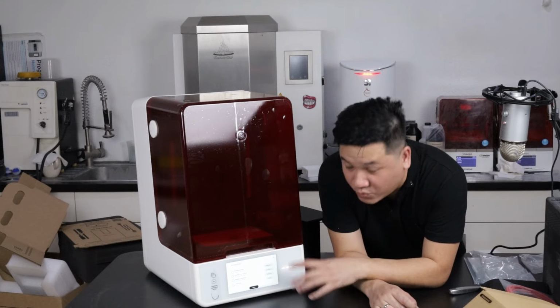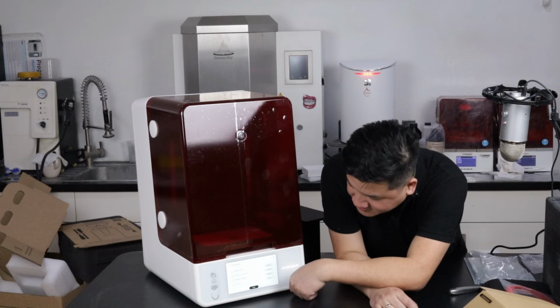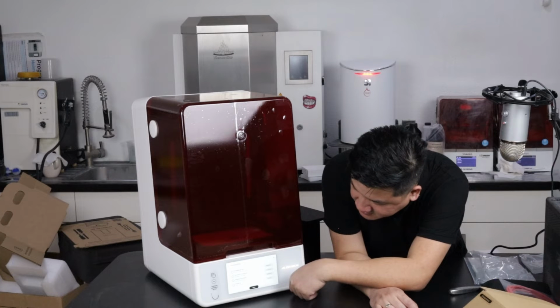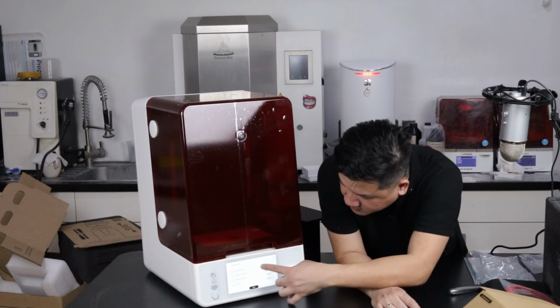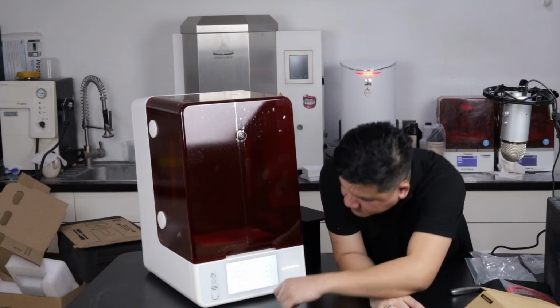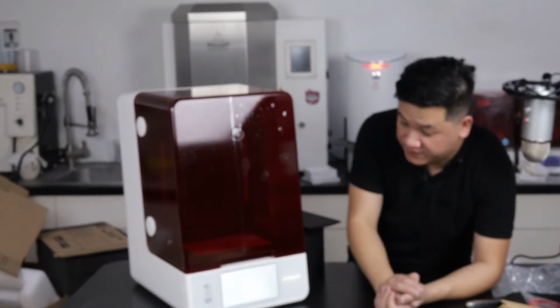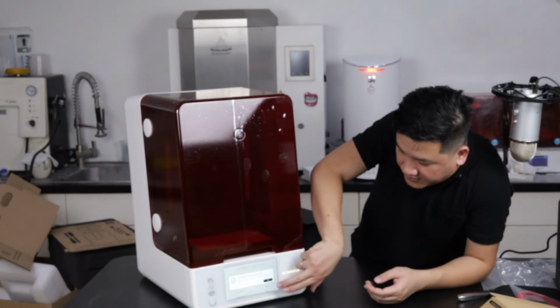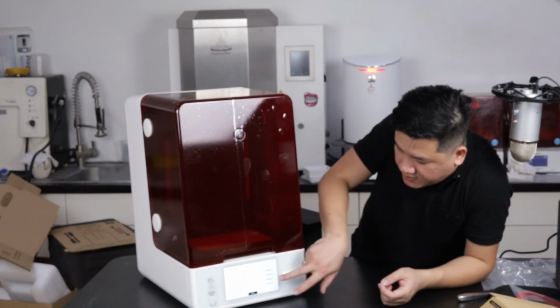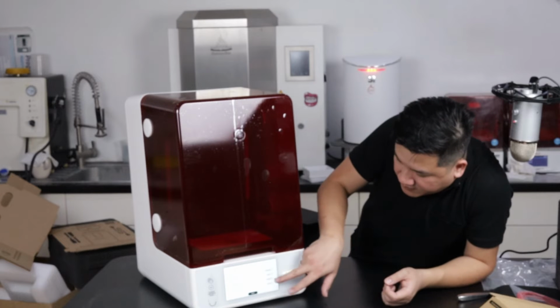Okay, so they've updated the touchscreen. This feels nice. Okay, so register. Into the register. Yeah, I really like this touchscreen actually. Using it is very, very nice. Okay, connected to the Wi-Fi. Network is good. Validate parallelism. Okay, let's do that first.